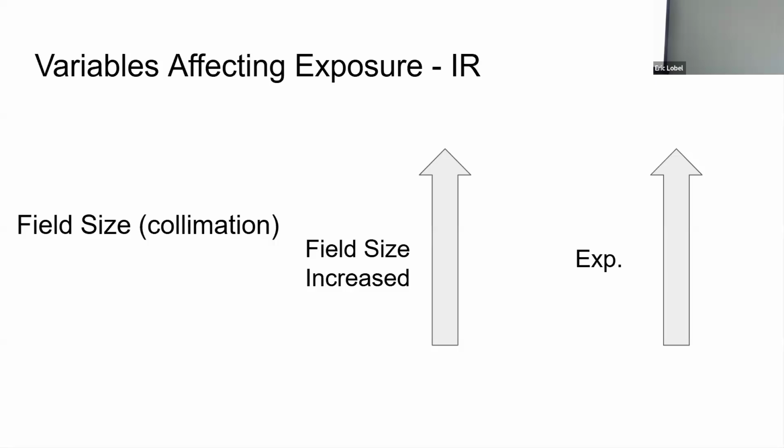However, do we still have more photons passing through the object, instead of being absorbed? So his question was, correct me if I'm wrong, essentially, if you increase the kV, do you get more radiation coming out of the patient? Yes. The amount of radiation in what we call the remnant beam, which is really the primary beam, but we change names if it actually makes it out of the patient. So the radiation that comes out of the patient is called the remnant beam. If your kV goes up and you penetrate more, then you get more photons coming out.